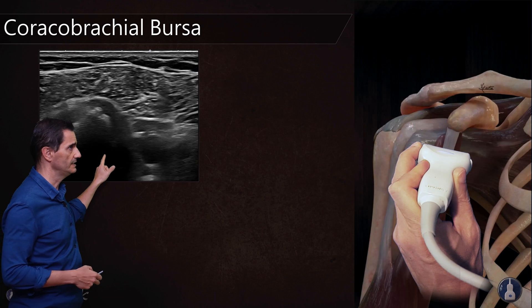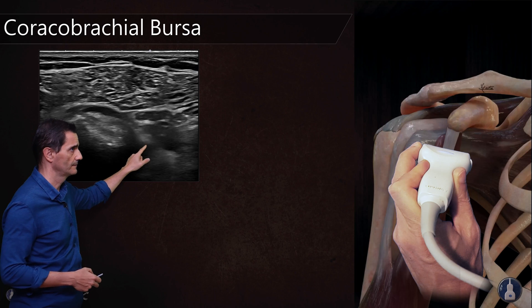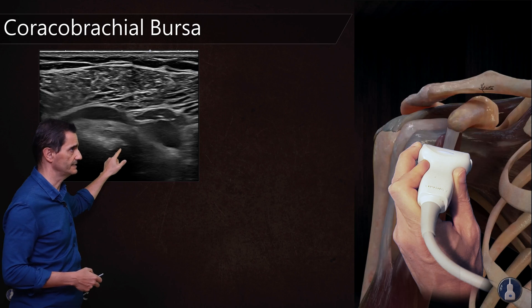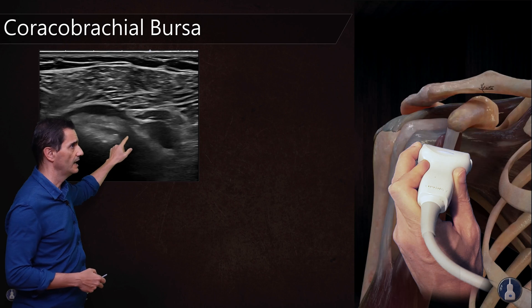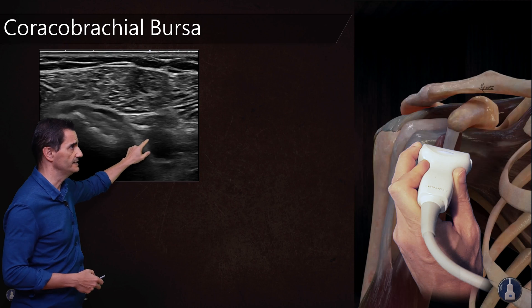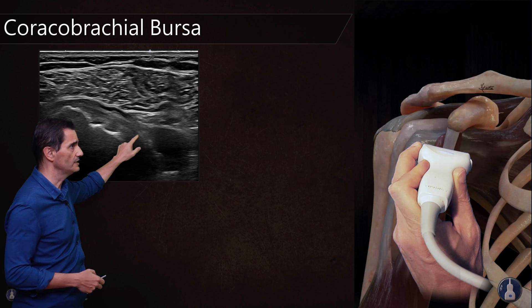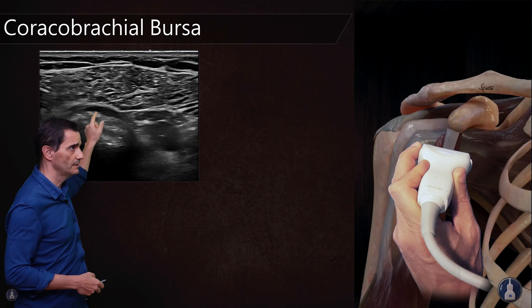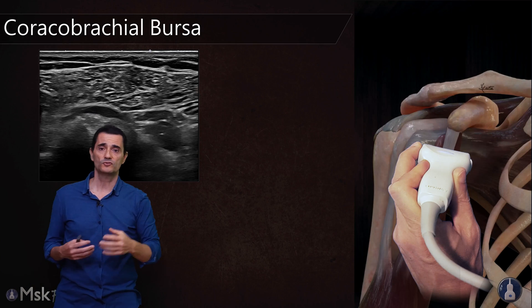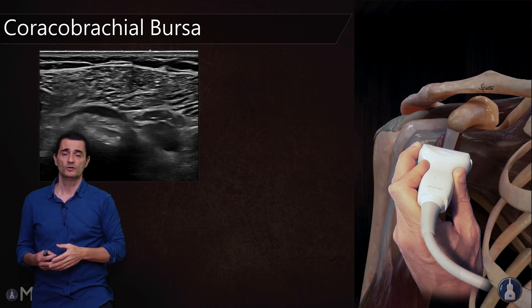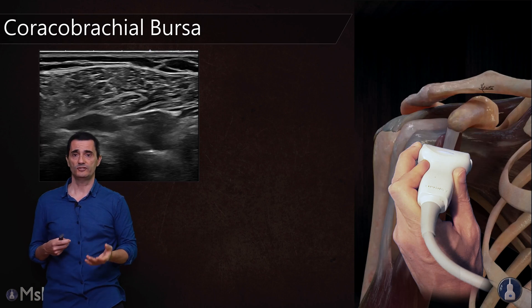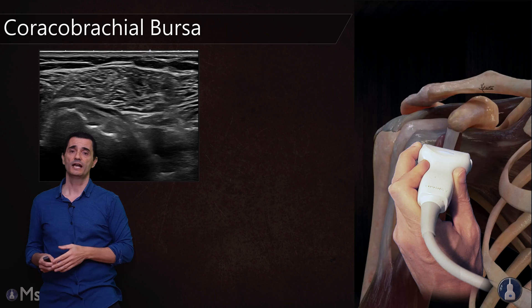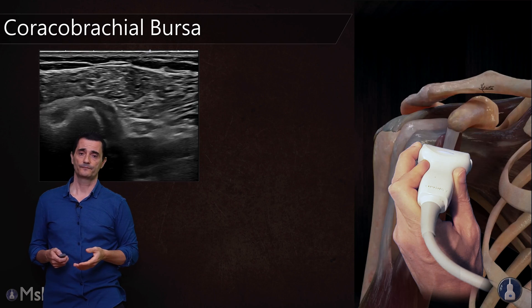You can see the bursa here. The subscapularis is this tendon. In this case, this bursa communicates with the subacromial-subdeltoid bursa, which is also pathologic. So it's not rare to see this communication between the subacromial-subdeltoid bursa and the coracobrachial bursa.